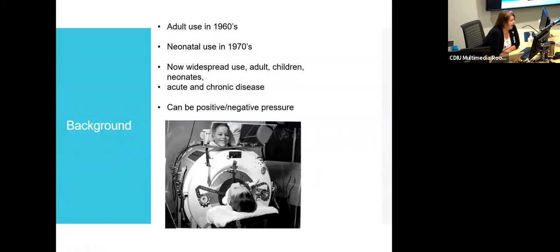So this is an external negative pressure device. Works fabulously well. It is physiological in that the way that you and I normally breathe is to generate a negative intrathoracic pressure, and that creates a pressure differential, which then creates a flow, which then helps us to breathe in. Very simple physiology.